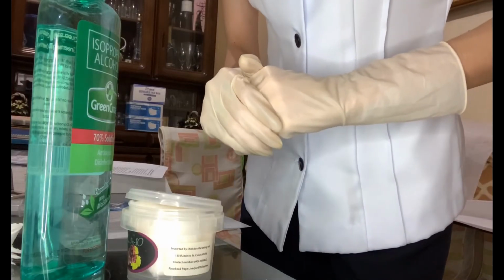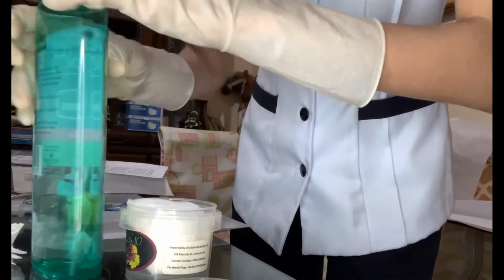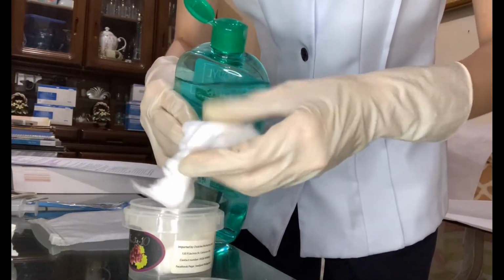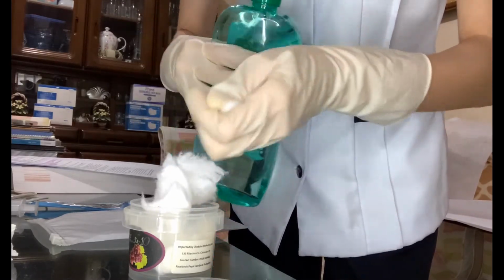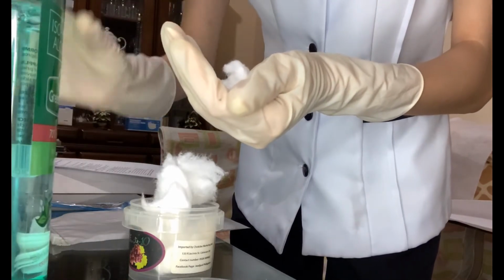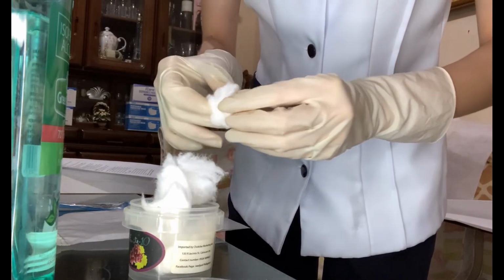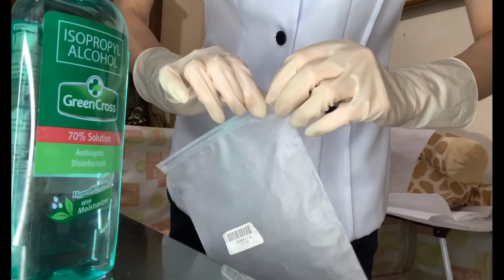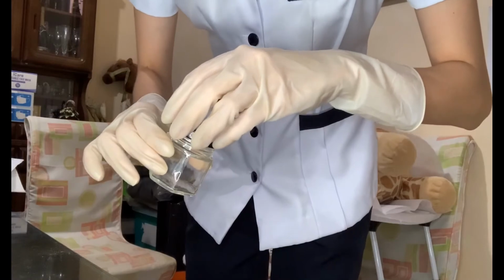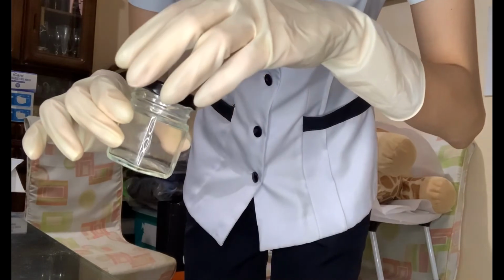So now we will saturate the cleansing balls with antiseptic solution. Next is to open the lubricant package and remove the specimen container and place it nearby with the lid loosely on top.